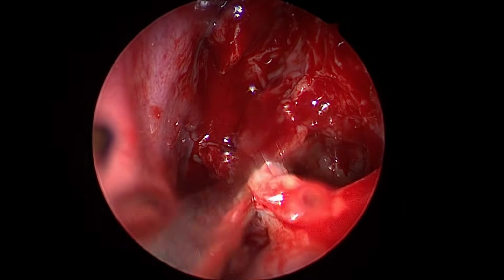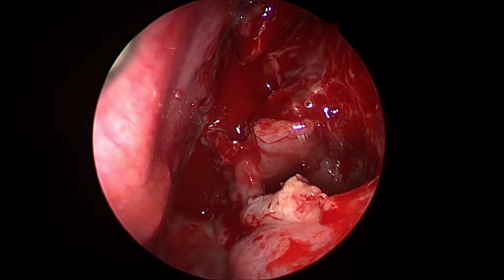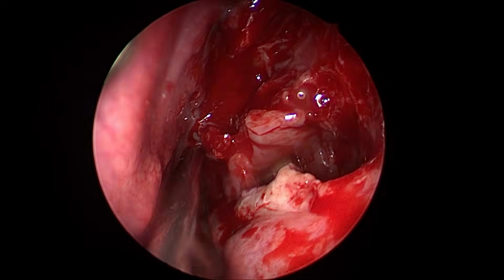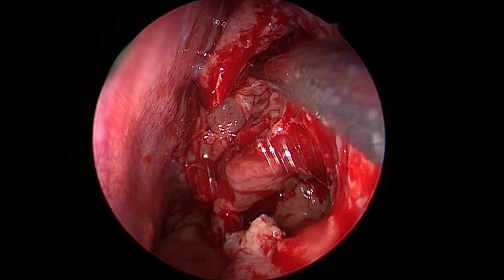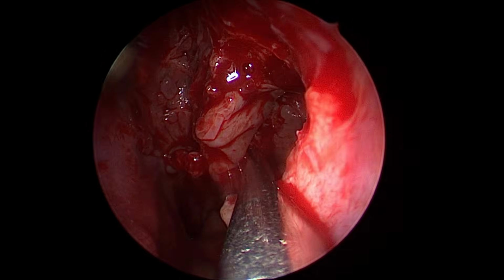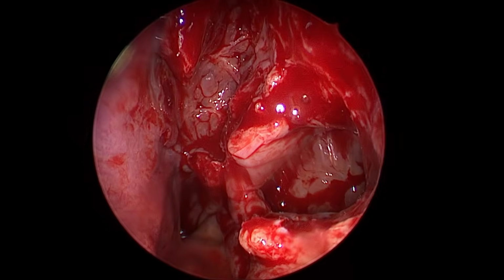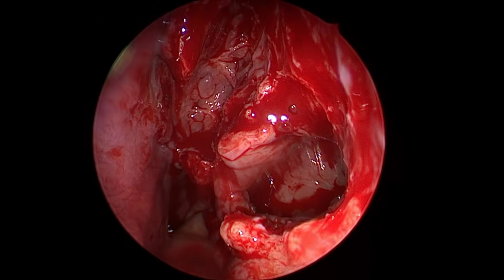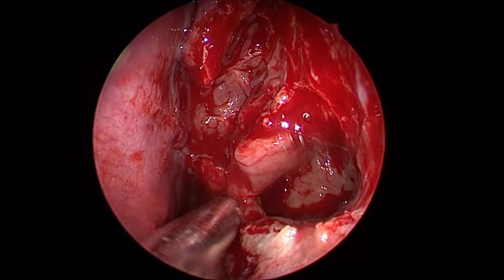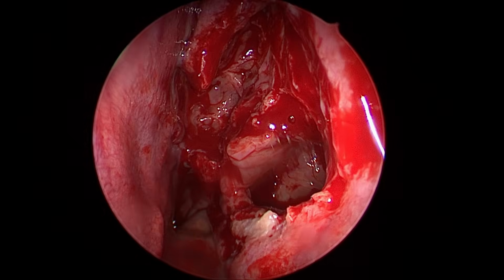This is a FESS surgery, functional endoscopic sinus surgery. And function is served by the mucosa. If you radically remove the mucosa, that is not FESS, that is mess. Say this: preserve the mucosa. You have to be gentle on mucosa. You need to know when you are supposed to be aggressive, when you are not.